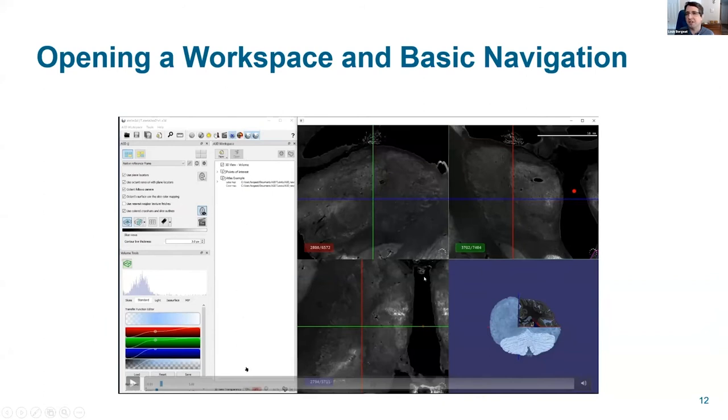This is everything contained as a supplement to the BigBrain or your histology itself. If you have an atlas or intermediate results, they're all organizable and displayable here, as we'll see as we move forward. So Philippe, don't hesitate to intervene, or anybody else on the panel, if I'm missing obvious things. I'm trying to go quick so we have time for questions.